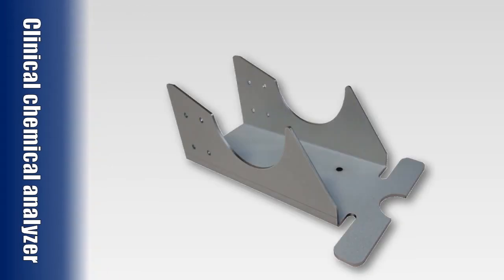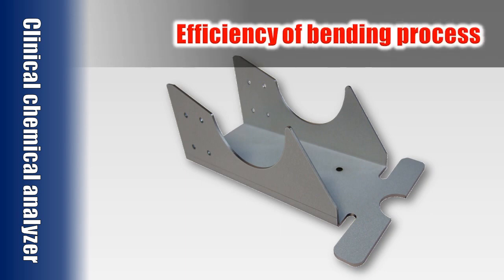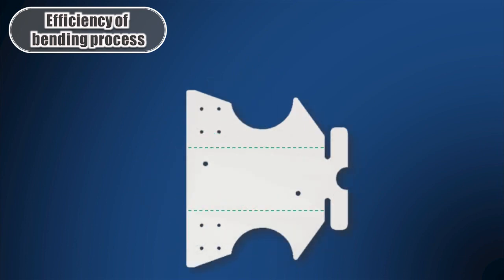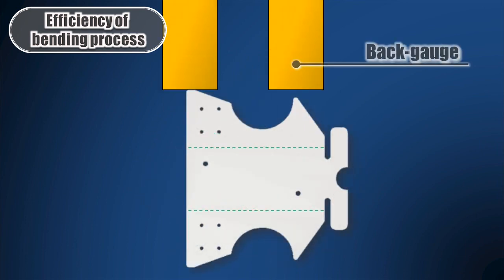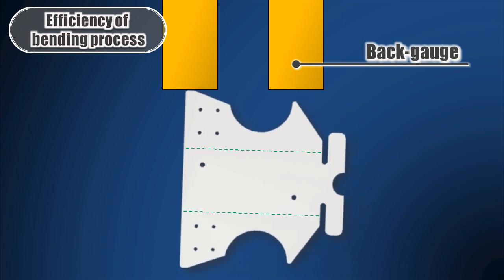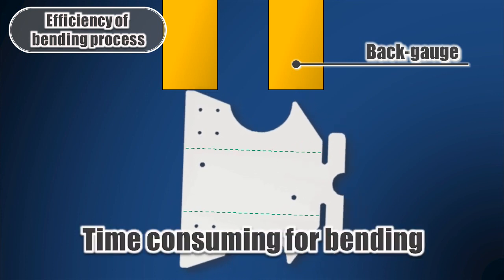For the second case, we will take the small bracket as the example to show how we can improve the bending efficiency. Its characteristics are the many complicated shapes, and it is often difficult to bend due to unstable gauging. The operator tends to get very cautious and takes long time for bending.